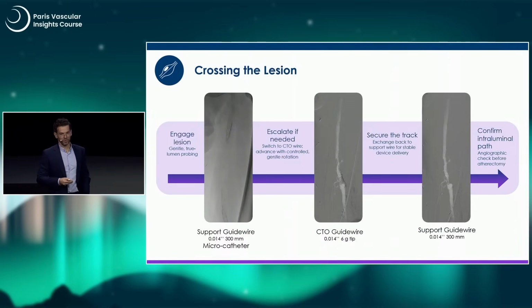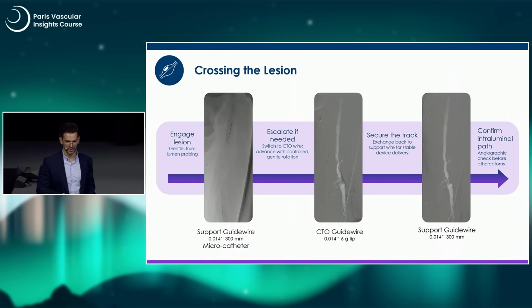So we finally decided to treat this patient with rotational atherectomy, because we want to gain lumen, modify wall compliance and remove some plaque. So the crossing was not really an issue. I first started with the support guide wire that we usually use with Jetstream. So I started with the Spartacore, which is of course not a CTO or crossing guide wire.